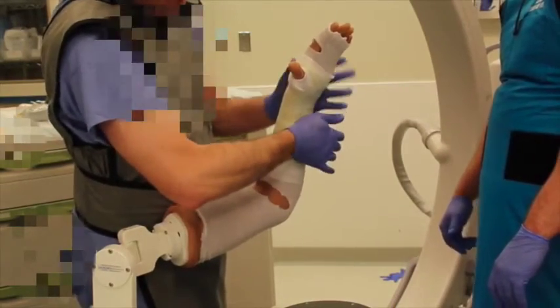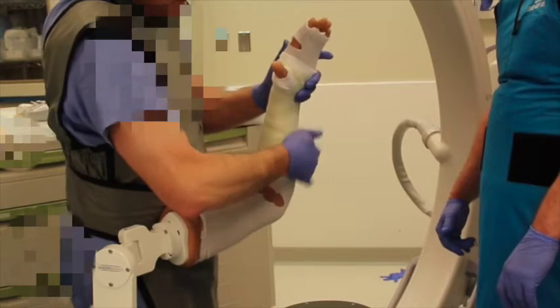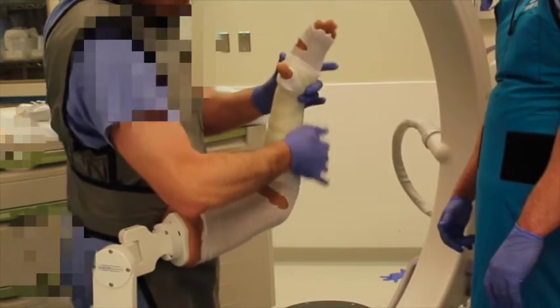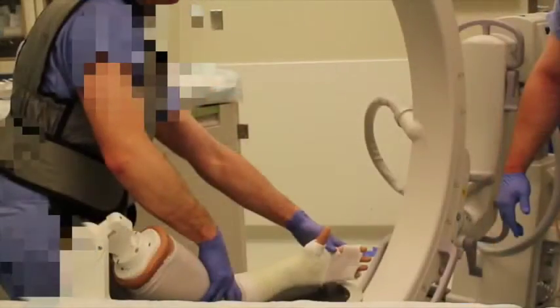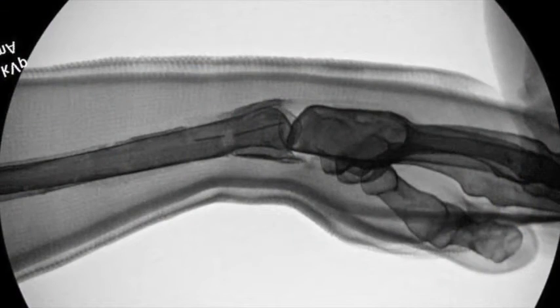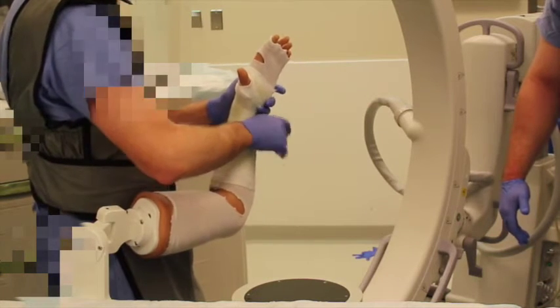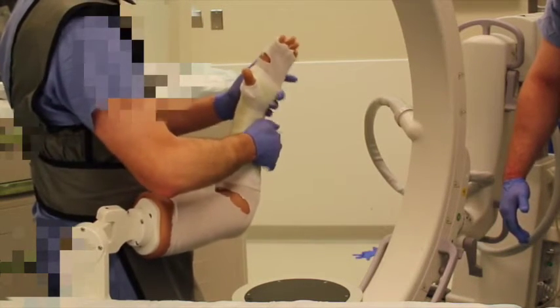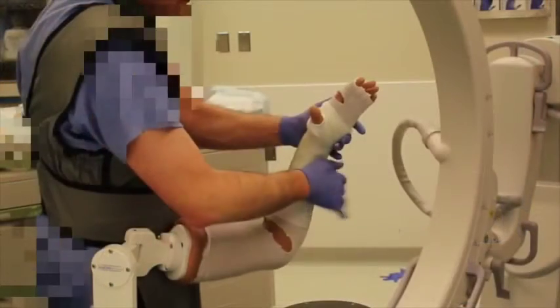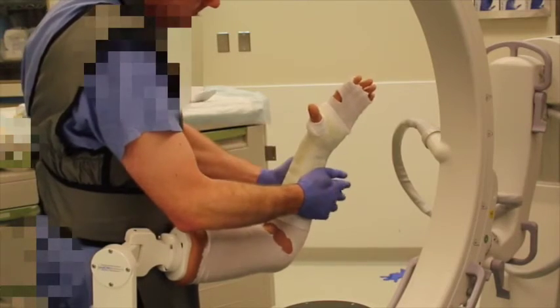With the cast applied, gentle molds are then placed at the volar aspect of the fracture site, just proximal to and distal to the fracture site, creating a three-point type of bending mold in the cast. The reduction and molding can be checked with fluoroscopic imaging. The hypothenar and thenar eminences of the hand make good tools to create a nice broad mold, so as to prevent direct pressure points of the cast onto the arm.